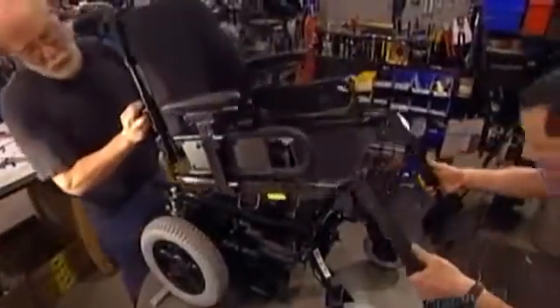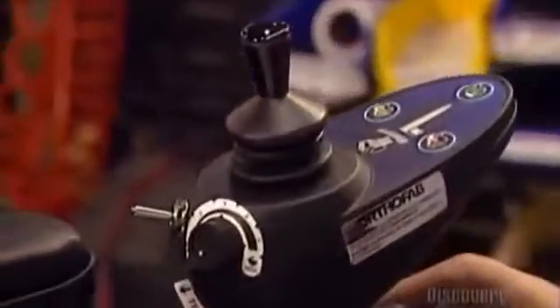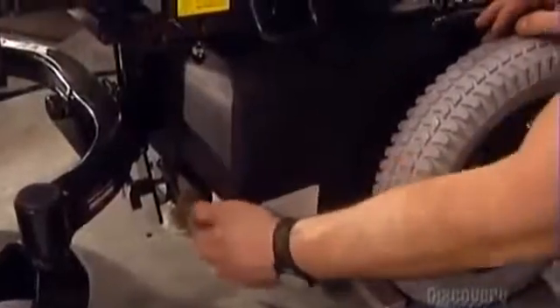They attach the seat and the joystick box, which has on-off and speed control switches. The battery pack provides 85 amps an hour — enough power for 16 hours or 40 kilometers.